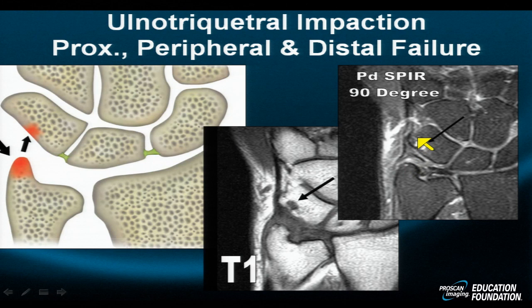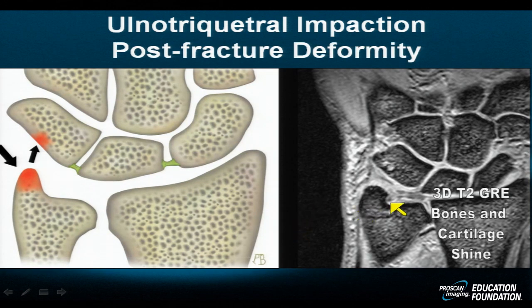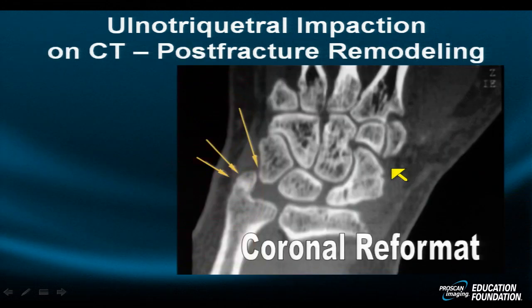Another example of ulno-triquetral impaction is demonstrated in this patient with a dysplastic, fat, broad ulnar styloid. Small pseudocysts on both sides of the triquetrum and ulna are identified. The peripheral aspect of the TFCC is inflamed all around the ulno-meniscus homolog. Synovitis surrounding the ulnar styloid involving the ulnar styloid recess and extending into the fovea is apparent on the T1-weighted image as intermediate signal intensity. On the gradient echo image, degeneration and inflammation has extended into the triangular fibrocartilage itself, and pseudocysts from abutment in the triquetrum have resulted.